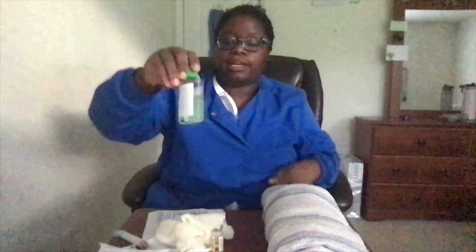Now, I'm going to open the curtains per your preference. Throw away my gloves. And I'll see you in an hour, Anna. This concludes my intramuscular video.